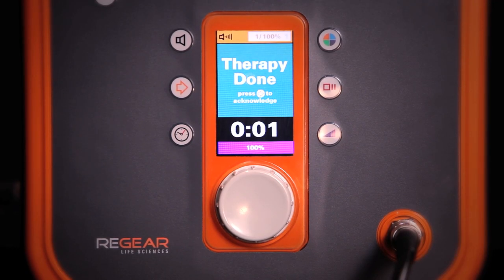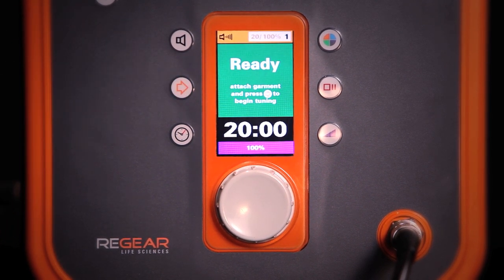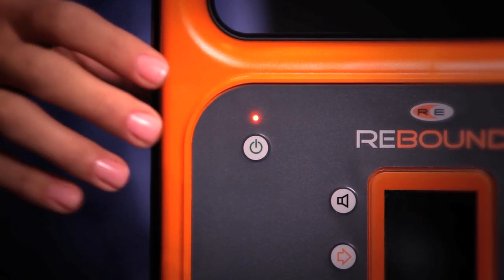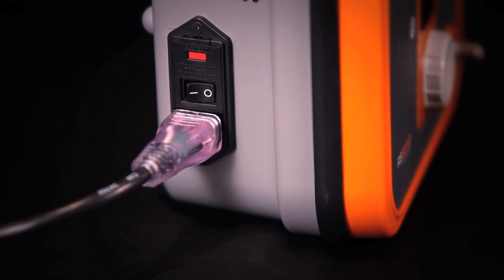Once the therapy is complete, press the continue button to get back to the ready screen. It can now be used on the next patient. When you're finished using it for the day, simply press the soft power button, then switch the power toggle to the off position for storage.